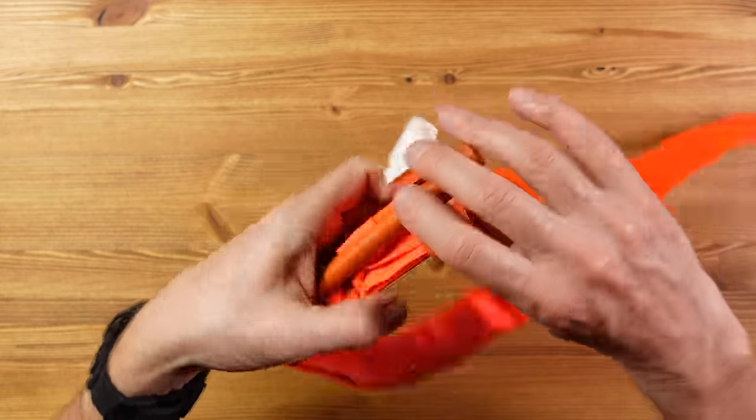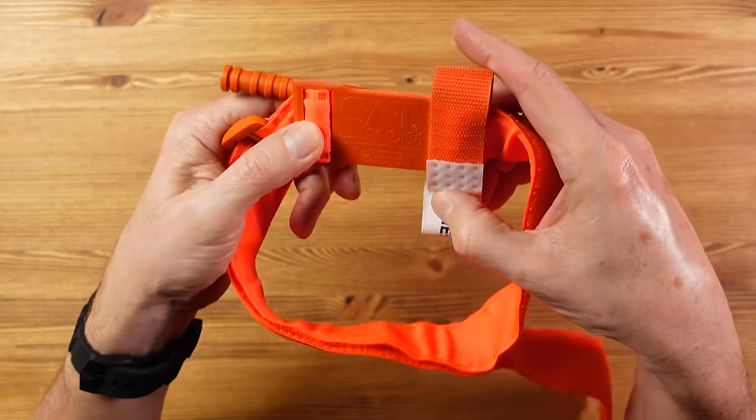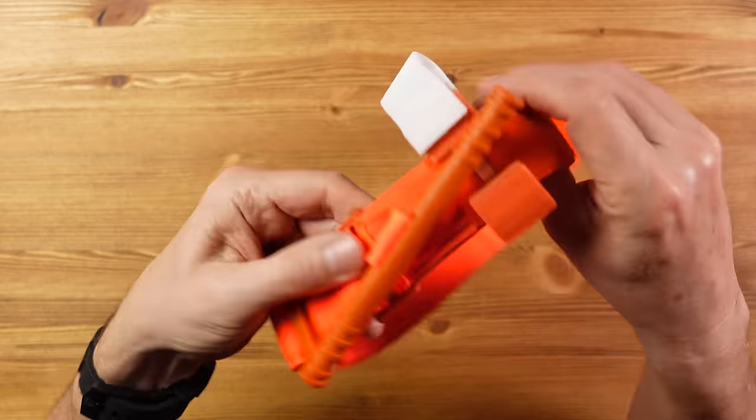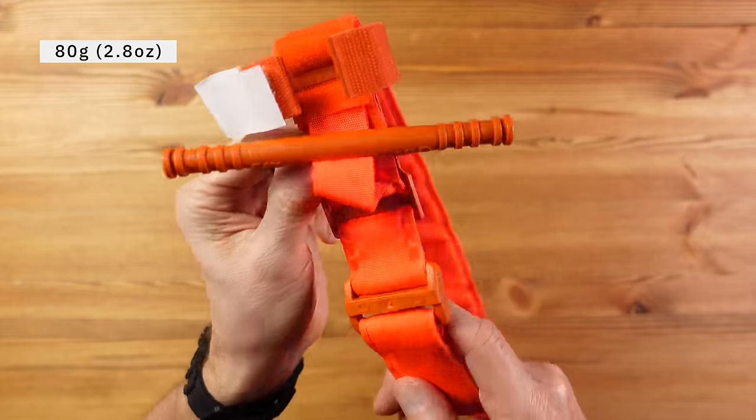Ideally clothing would be cut away so that the tourniquet can be applied directly to the skin, but if the situation demands and there isn't enough time, it can be applied over clothing. It's also been tested to be effective with children, even young children. And there's no immediate panic to remove the tourniquet — it has to be on for six hours or more before permanent muscle or tissue damage can occur, although under two hours is often recommended. The benefits are that it works, and this type works really well. It's lightweight at just 80 grams, and it is quick and easy to use and can be self-applied.